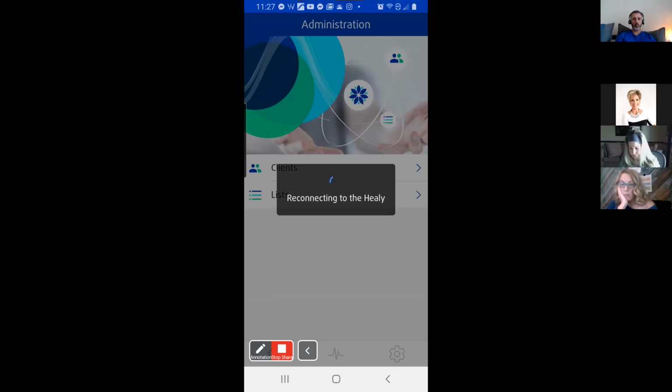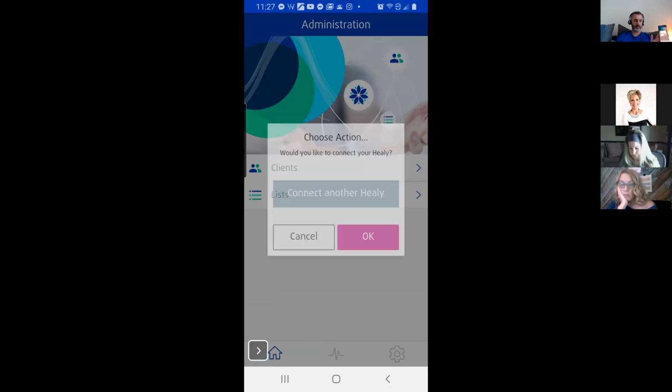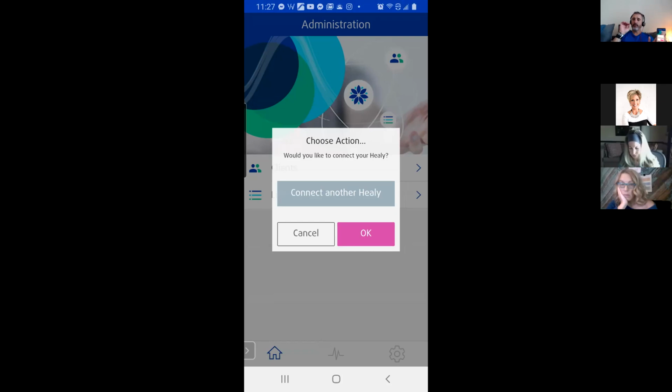Okay, now here's one thing to understand tech-wise. The Resonance app, if you do anything else besides be in the Resonance app, it disconnects from Healy, and it can be a bit of a pain, okay? So keep that in mind. If your phone, to save battery, is designed to go into screen saving mode every 30 seconds, you're like, what's up with the Healy? It disconnects from my device every 30 seconds. It's like, yes, not the Healy.